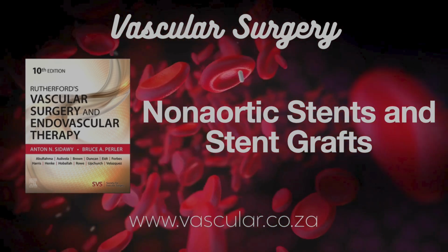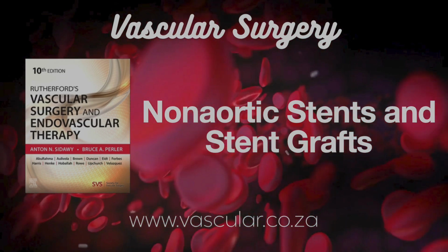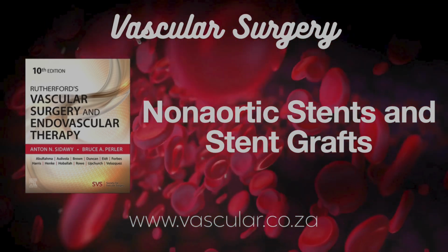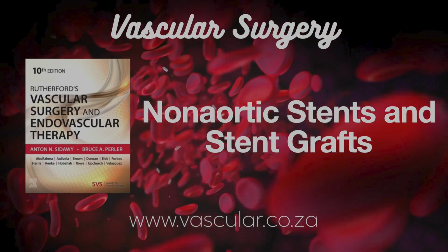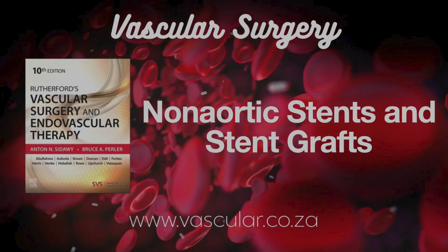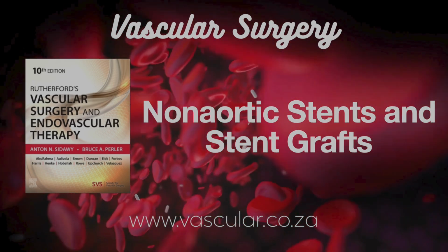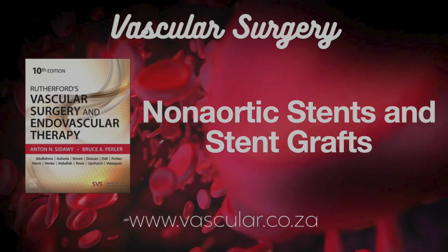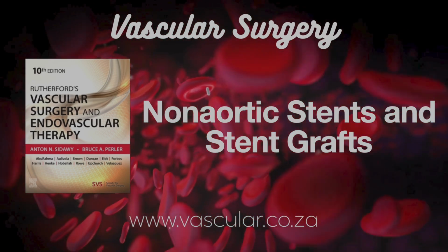Pseudoaneurysms, unstable plaque that might break off, even holes or perforations in the vessel, the cover seals it off. And traps debris too, presumably. Yes, that's another advantage, potentially reducing embolization risk during the procedure. Sounds very useful. Any downsides? The big one is side branches. The fabric covers everything, so if you need to keep flow going into important side branches, a covered stent is usually not the right choice.